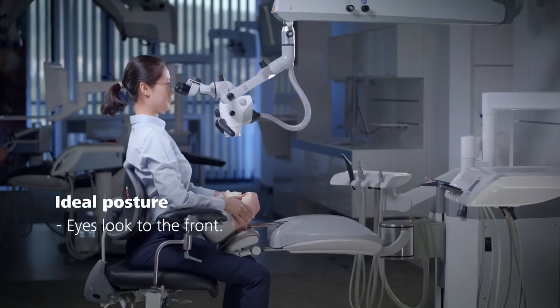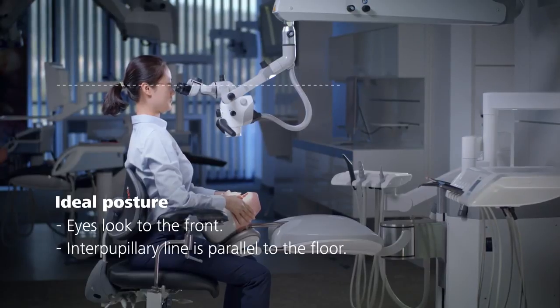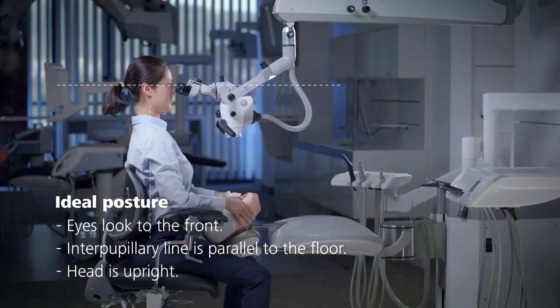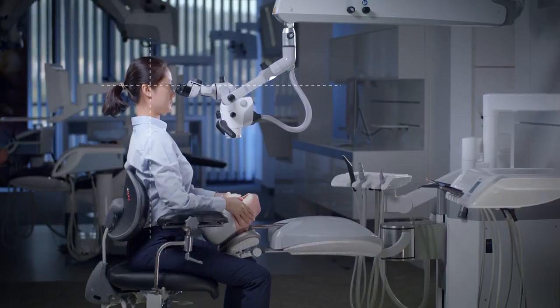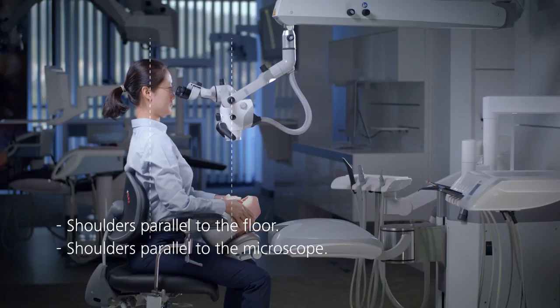It should be easy for you to look straight ahead. Your interpupillary line should be parallel to the floor and your head should be in an upright position. Your shoulders should be parallel to the floor and correctly aligned with the microscope. Your ears should be roughly over your shoulders.